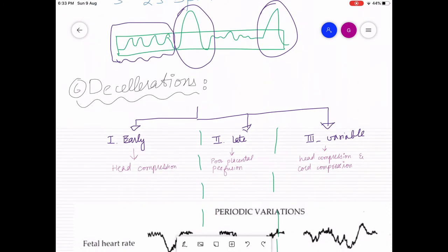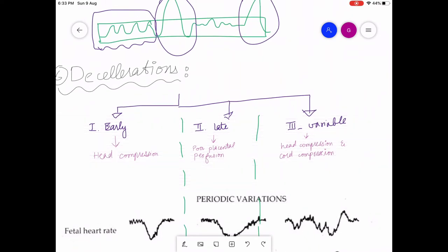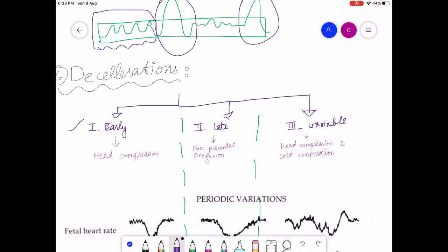Deceleration is the sixth point and has the same threshold as acceleration but is generally not a good sign. Decelerations are of three types: early deceleration, late deceleration, and variable deceleration. Early decelerations are due to head compression, which often happens during later stages of labor as the baby descends through the birth canal, or during early labor if the baby is premature or in a breech position.